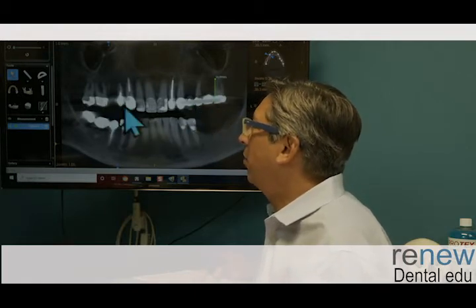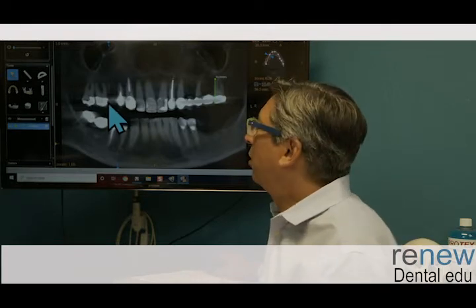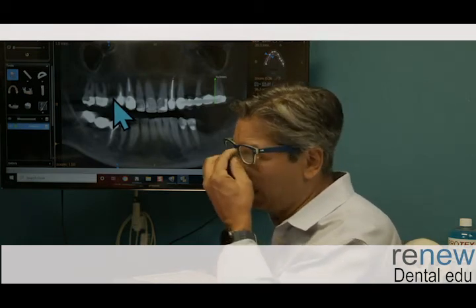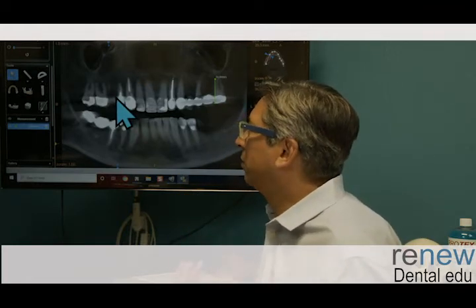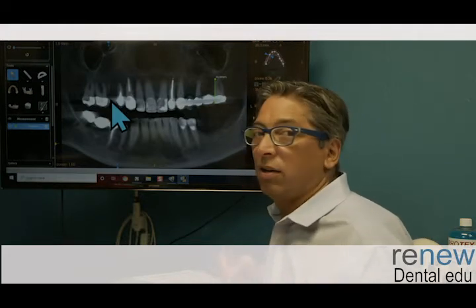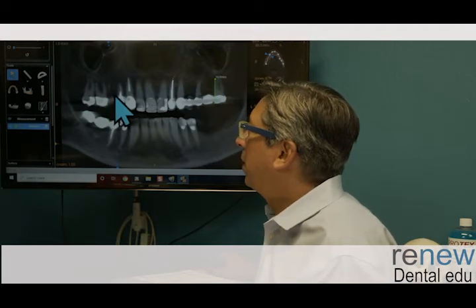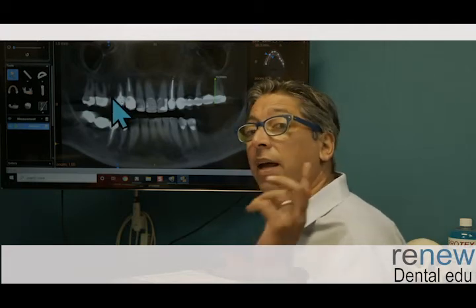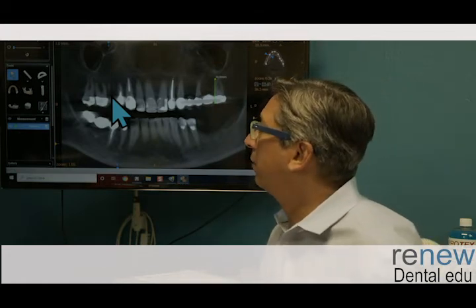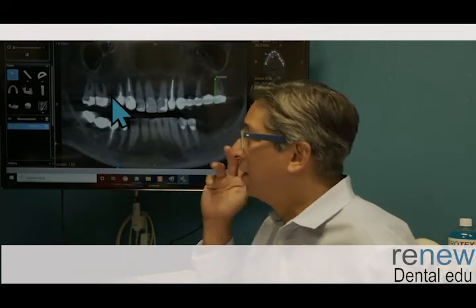This area here, I would probably recommend a 3-unit bridge, or I guess she wants to wait for the implant, and I hope that she is able to develop bone over the next 4 months or 3 months, I guess, at this stage on this one, to have some sort of bone fill there. She doesn't grow a lot of bone. She doesn't have a lot of heavy bone, so I don't predict that she's going to develop and grow bone in this edentulous site all that well. So this may be a curious scenario down the road. But like I said, this case is going to be a follow-up case, and we'll be looking at that later in the future to see where this is, because this case is at least 3 to 5 years old or something.